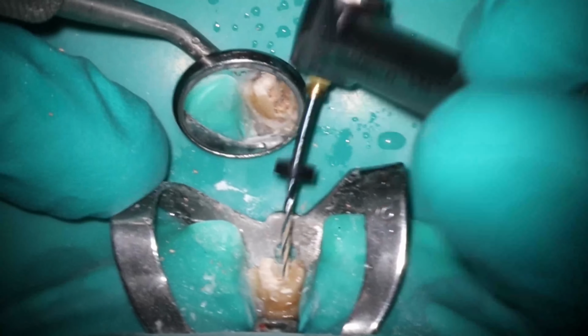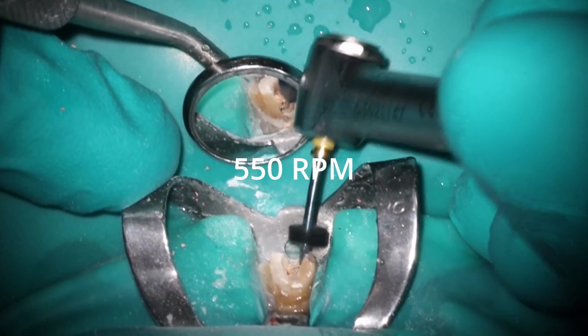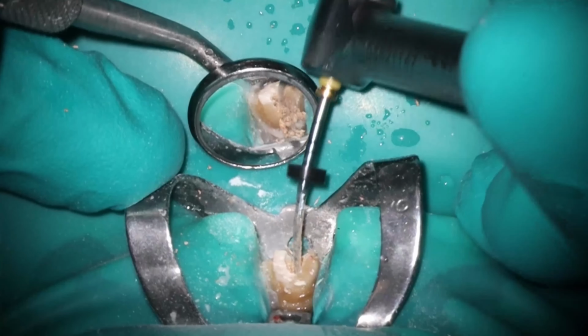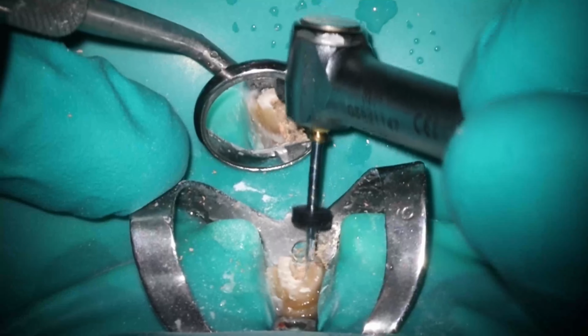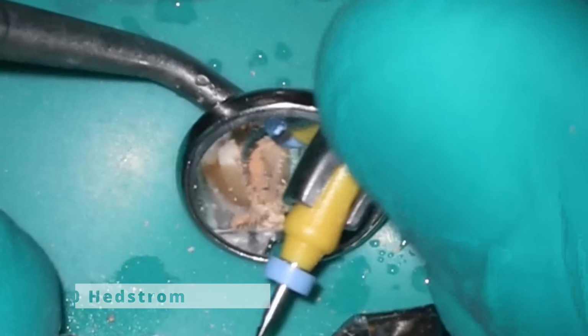You'll also notice I'm spinning this thing pretty quickly here, at 550, and that's because as it heats up, it's going to start to melt the gutta percha and make it a lot easier to grab, and I'll show you how I'm going to do that here in just a second. But notice how much I'm bending the file as I'm brushing back and forth. And the reason why is once it's all soft, you can use a nice large hedstrom, in this case a 50, which was the size of the F5 anyway, and remove everything in one big chunk. So this is a way that you can see it's a very, very clean technique.